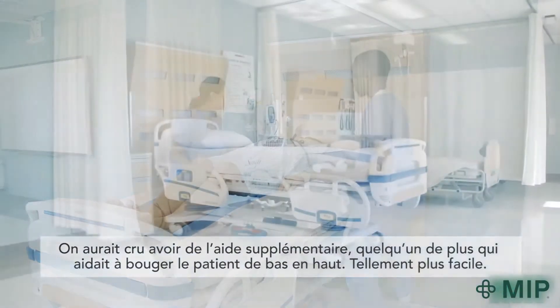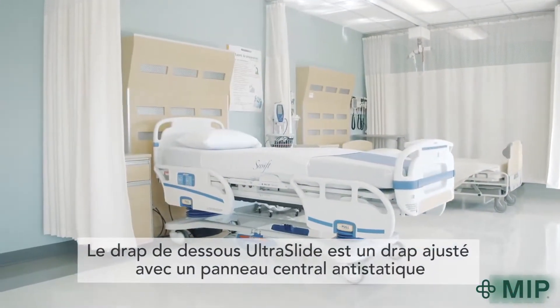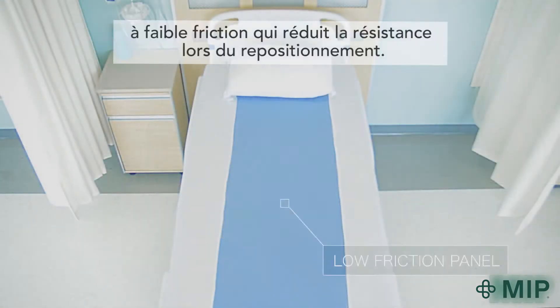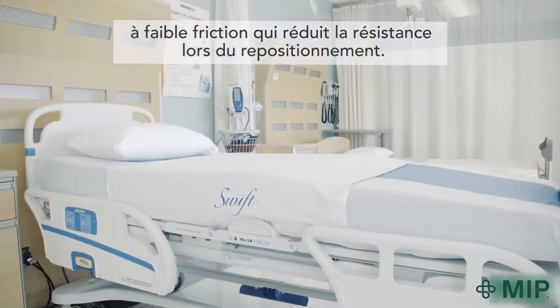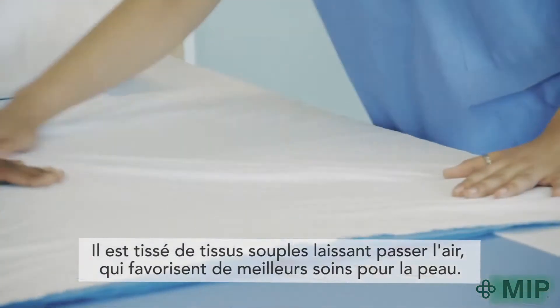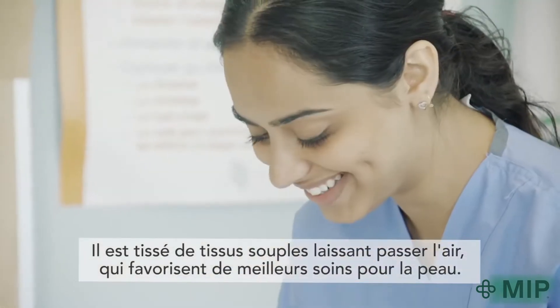It was so much easier. The Ultraslide bottom sheet is a fitted sheet modified with a low static, low friction panel down the center that helps reduce resistance during repositioning. It's made of soft, breathable fabrics that support superior skin care.